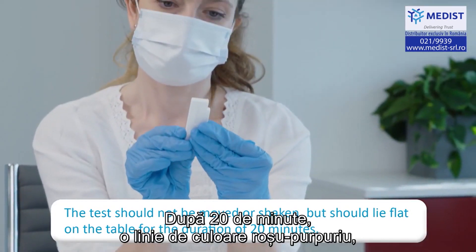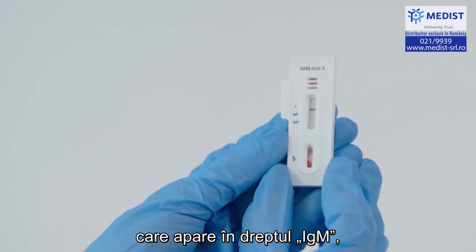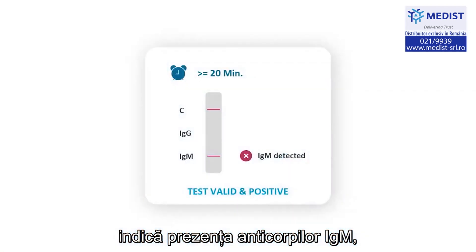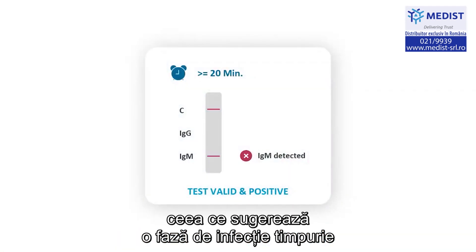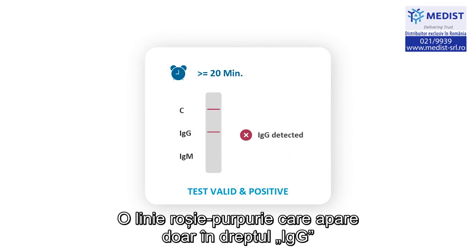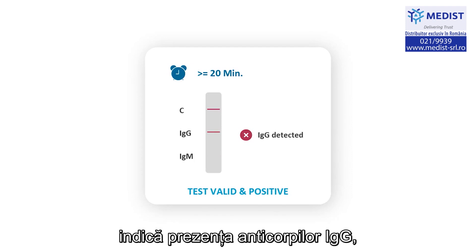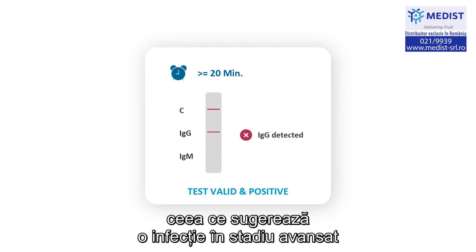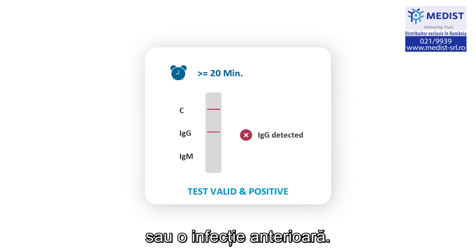After 20 minutes, a purplish-red line appearing at the IgM line indicates the presence of IgM antibodies, suggesting an early infection phase of SARS-CoV-2. A purplish-red line appearing only at the IgG line indicates the presence of IgG antibodies, suggesting a later stage infection or past infection event.